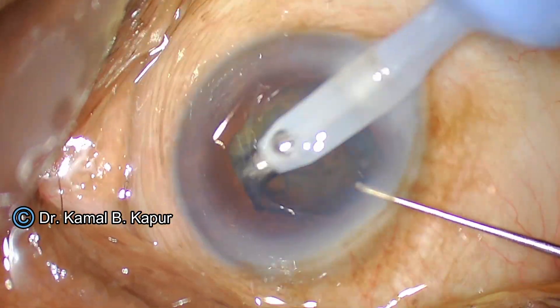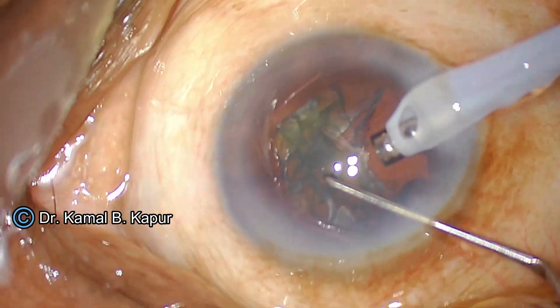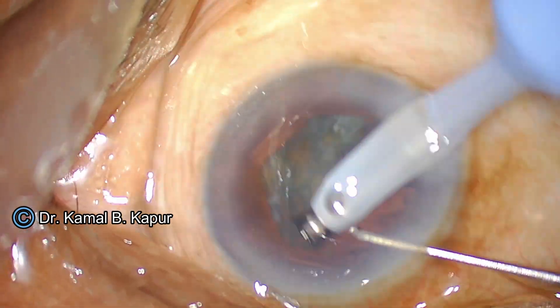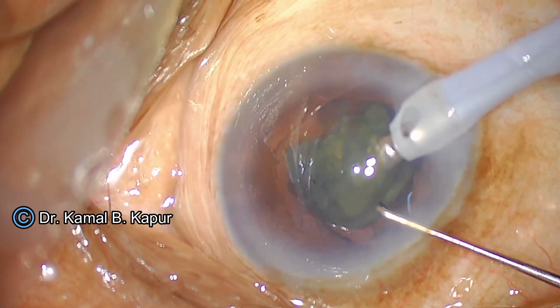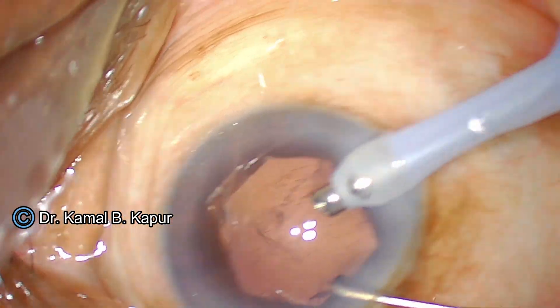You need to be very careful when operating such sticky cataracts, especially in bags with weak zonules. You should try and do more phacoemulsification and nuclear management at the iris plane. But while doing that in the presence of a B-hex pupil expander, you need to be careful not to dislodge the ring.